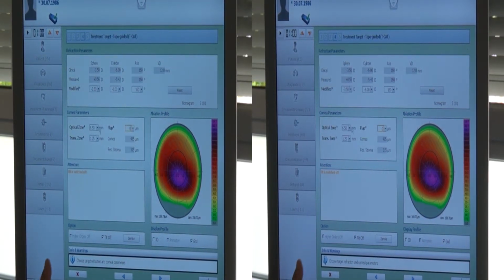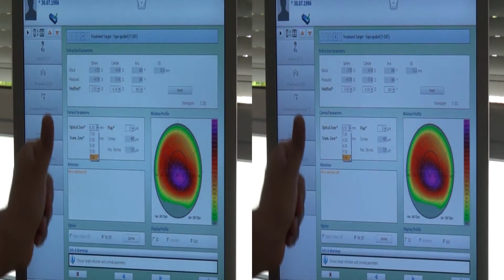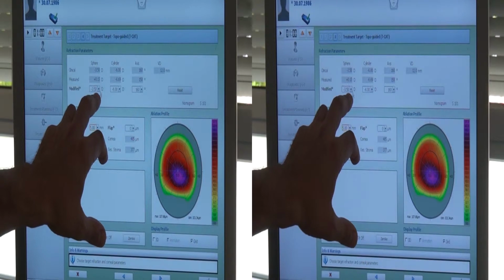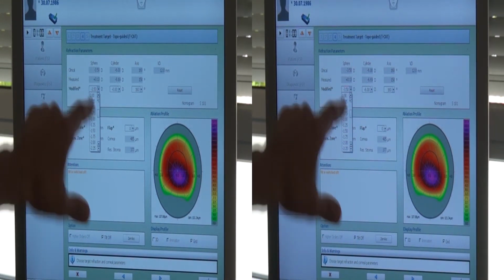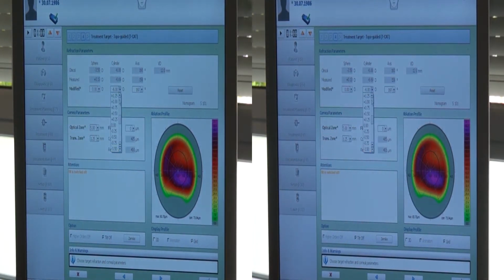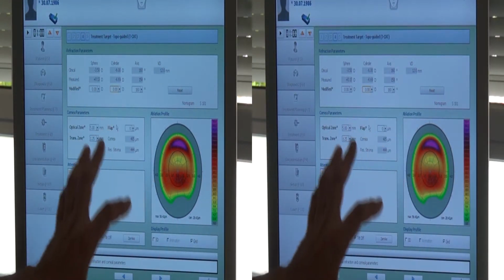Now, in order to understand what the topographer wants to do here, of course, we're going to make the optical zone smaller because we need to preserve tissue. We're going to try and zero the refractive components. So let's go to 0 on sphere and 0 on cylinder. So this way we'll see the attempt of the topographer to normalize this irregular cornea.